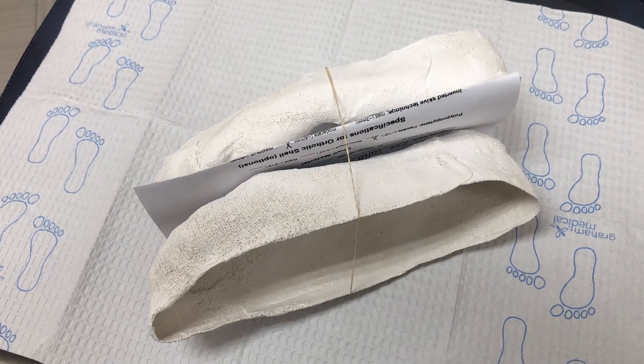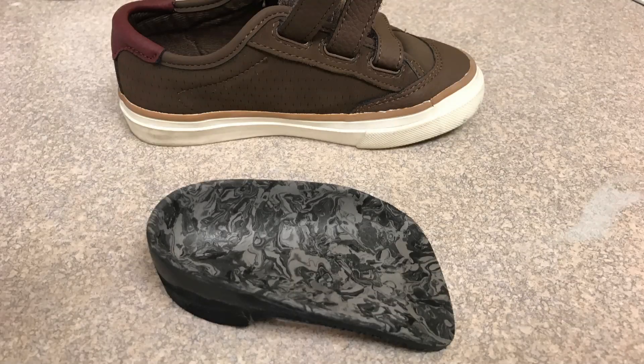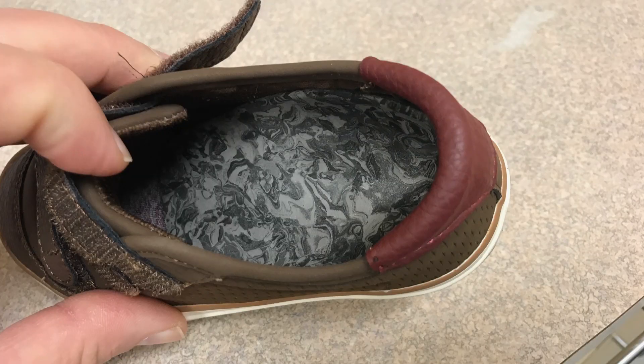The cast is then removed and sent off to the lab, usually taking about a week and a half, sometimes two weeks to get the orthotic back. Once we get it back, we put it into the patient's shoe and make sure it fits. Custom orthotic casting is a great way to obtain a very accurate impression and to have a very successful outcome with orthotic management.